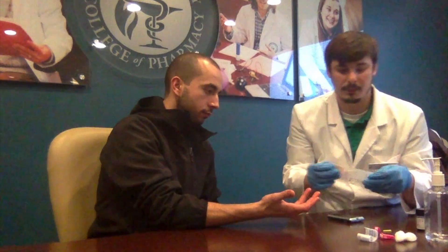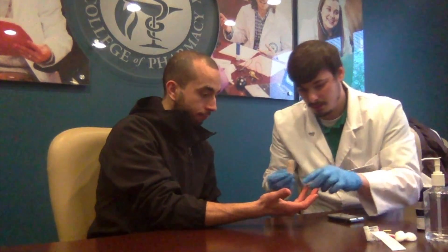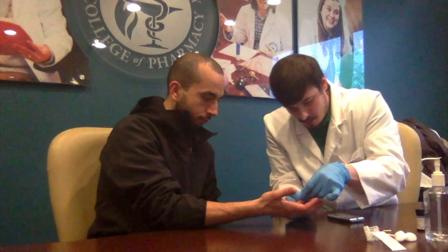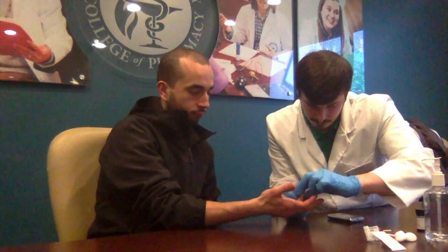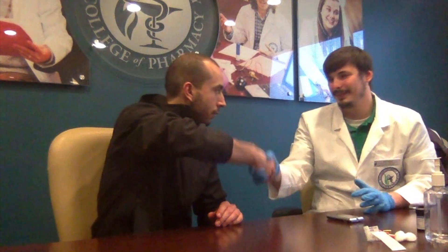So since we're done, what questions do you have for me? No questions. Alright. I want to talk to you about disposing of the lancets. Once you're done, you don't just want to throw it in the trash can — you want to either put it in a sharps container or put it into an empty carton like a milk jug or a two-liter, and then put it in the trash can. Thank you very much. Very nice meeting you.